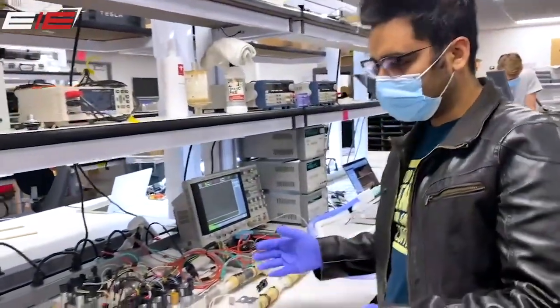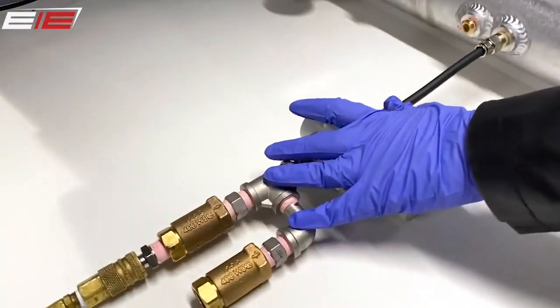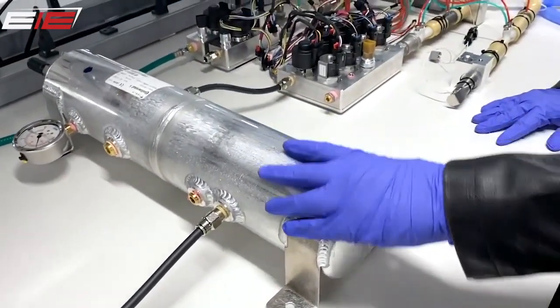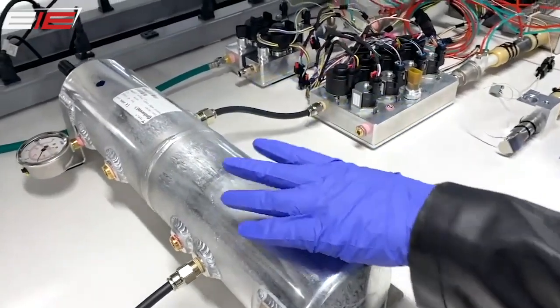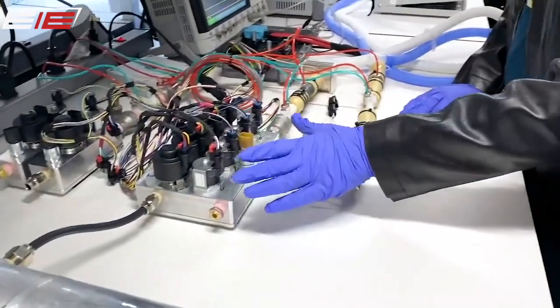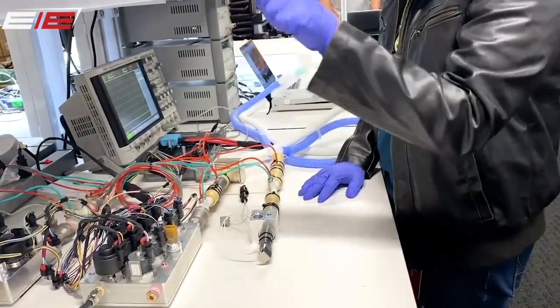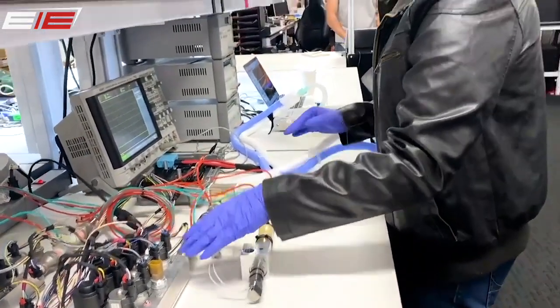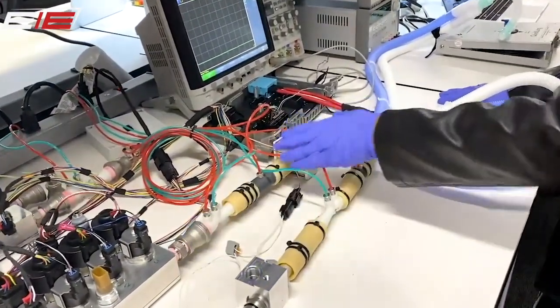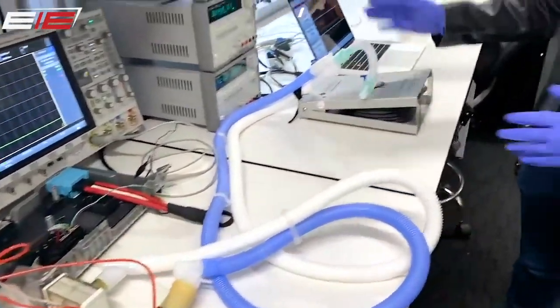Hi everyone. So I'm going to walk you through the first prototype we've built. This is the hospital grade supply of air that is going into a mixing chamber, which is a car part that we use in our vehicles. This is where the oxygen and the air mix together, and then it passes through a valve body, which is used to create the pressure and the volume waveforms. Then the air coming out of this valve body goes to a bunch of sensors. So this is a flow rate sensor, this is a pressure sensor. It then goes through a filter and goes into the patient's lung.